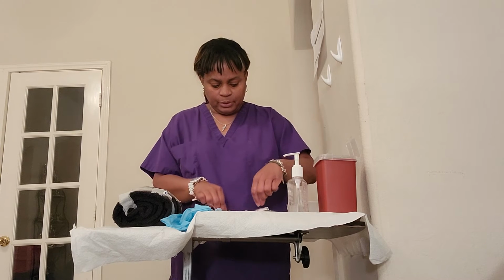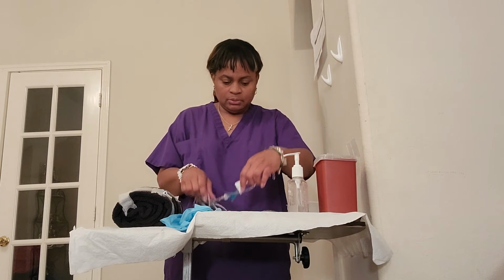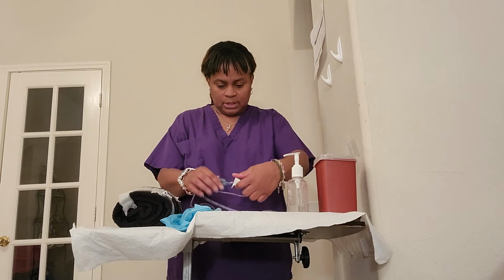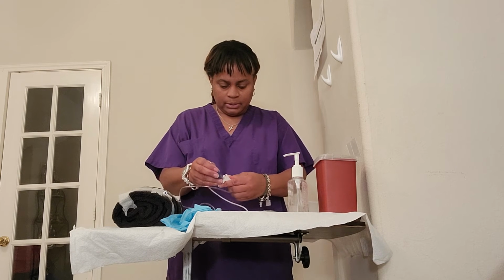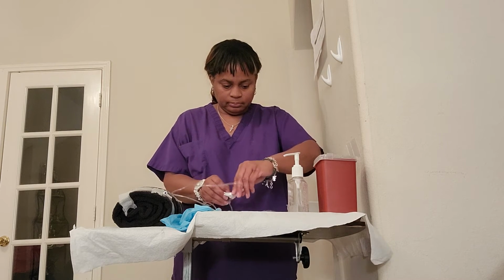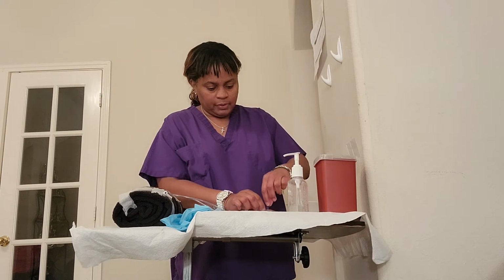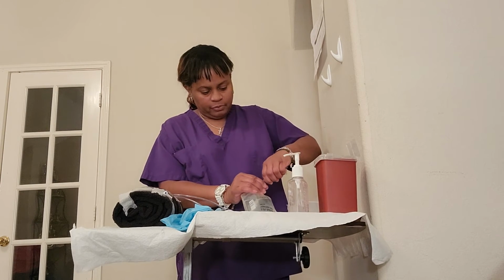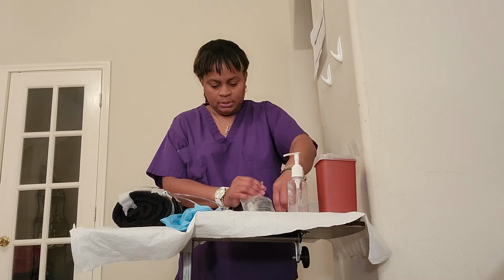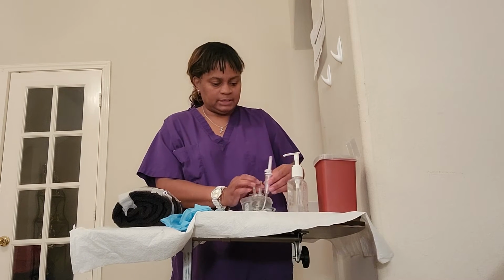The first thing that I'm going to do is close the clamp on this, so that way all my fluid doesn't run everywhere once it starts. Okay, I'm going to invert the bag and remove this blue part, being careful to keep aseptic technique.